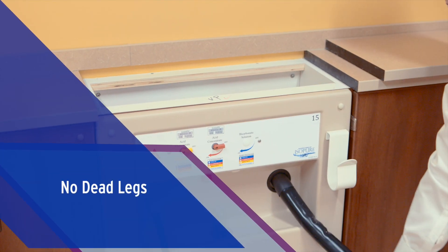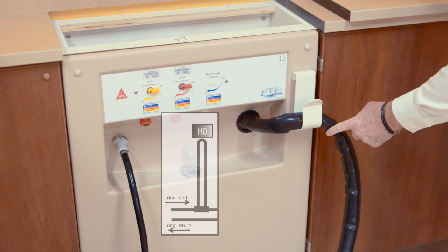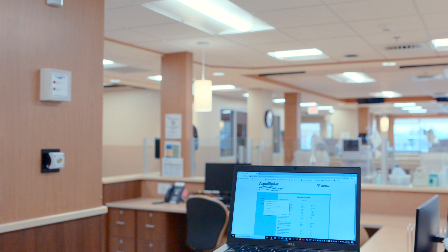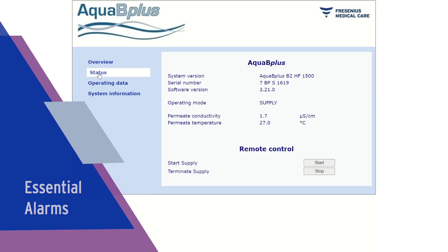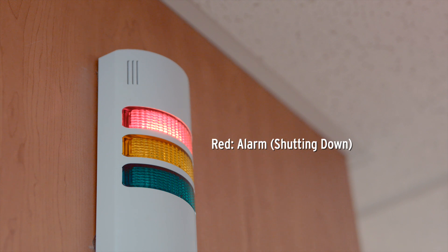There are virtually no dead legs in the double pass system, which enables water to flow to the top of the machine and return. This system design helps to ensure that water flows freely, preventing bacterial growth. On the treatment floor, nurses and patient care technicians can quickly identify potential water or concentrate issues with visual and audible alarms to help ensure delivered water is safe for patients.